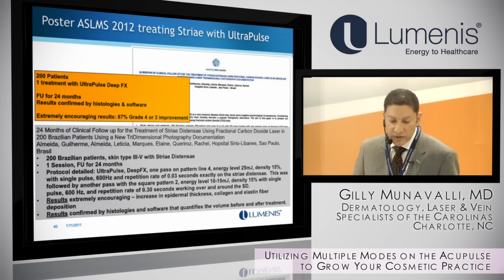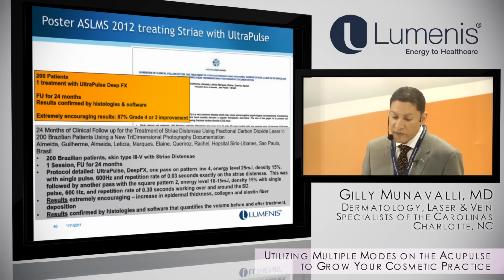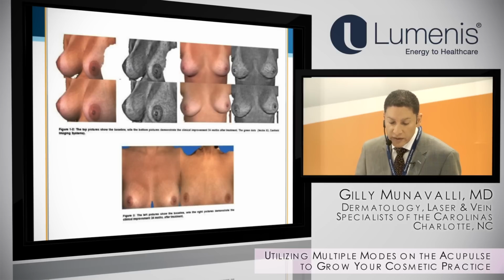This was a study that was done out of Brazil, and I don't know if Guillermo is here at the meeting. He used UltraPulse, and we found similar results with some of the patients, but this was a very large study in treating, and we've had some good results treating stretch marks on the breast, stretch marks in the abdomen.